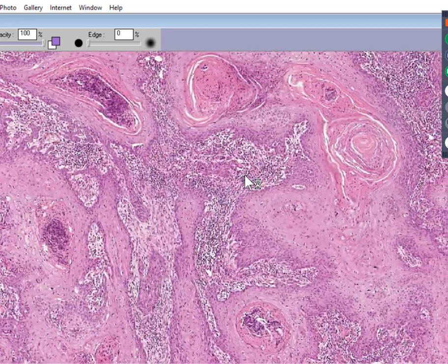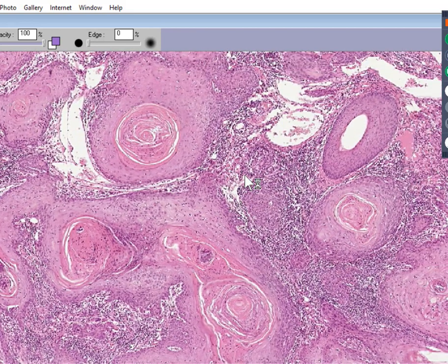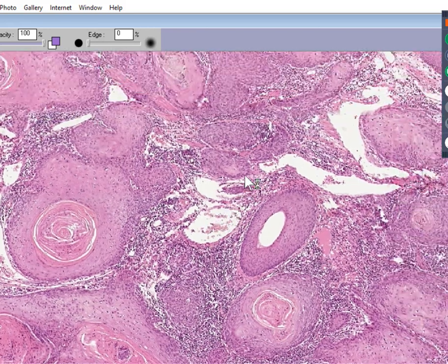invading. So by now you know that this is not only a squamous cell carcinoma of the skin, but a squamous cell carcinoma that is well differentiated, because it looks very much like the skin, and it even has these differentiated pearls like here and like here.